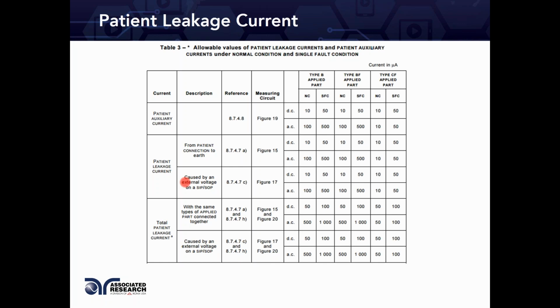Does that cause additional leakage to your applied part? Normally the design of the medical equipment does not allow it. It is really well isolated and shouldn't allow any kind of voltage felt at the signal input to affect the applied part. But this is what you're trying to measure during either the design phase and also during production type testing.